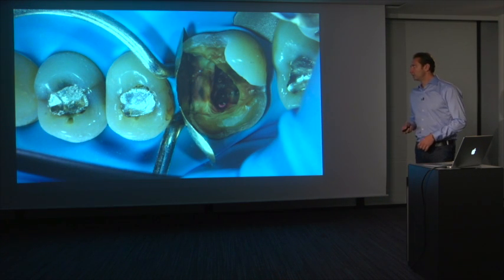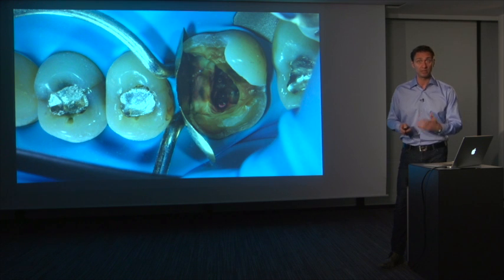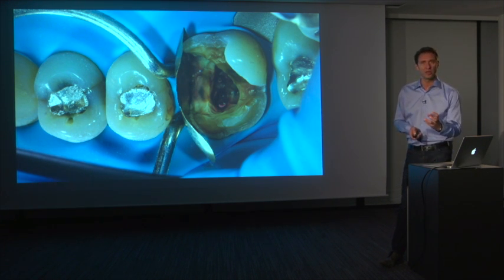And here, this is the best example of how the wedge was not used as a means of adaptation of the matrix. Here the old rings with the flat little feet were used to adapt the matrix to the teeth. So no need to make any contact point. So be creative. Use the ring to adapt it to the base of the cavity. You need something that is completely sealed off.